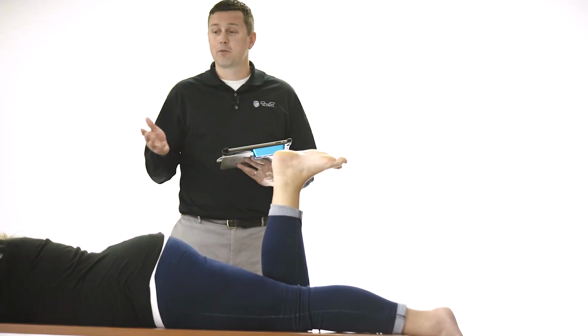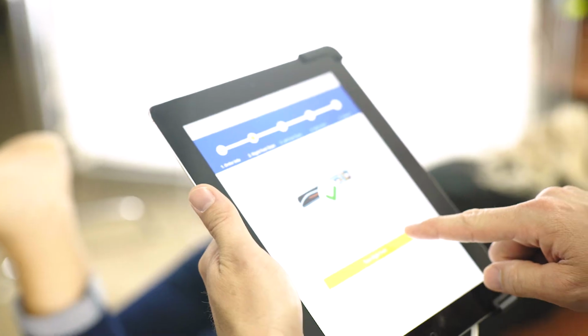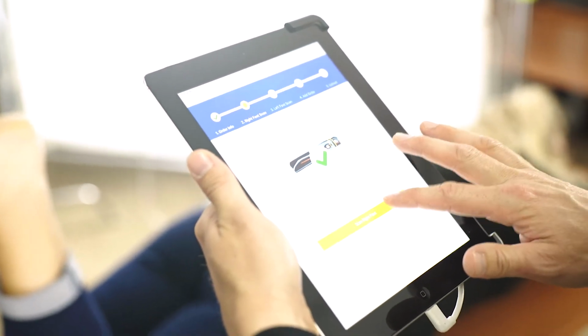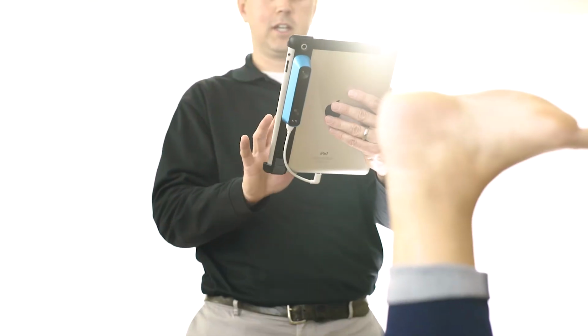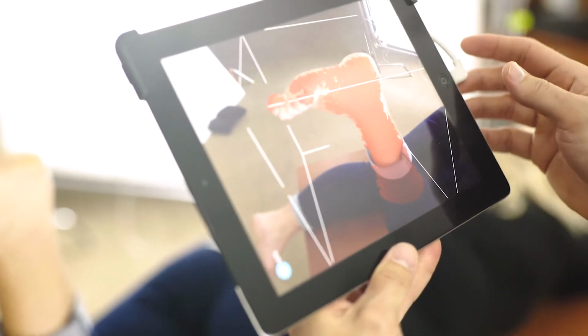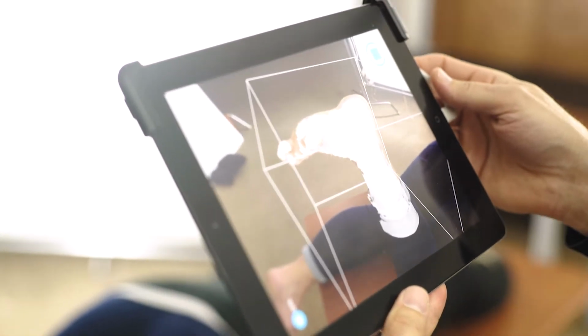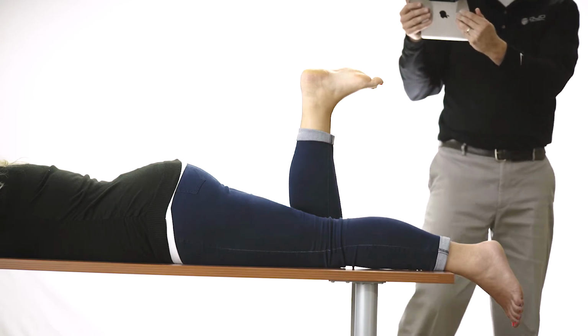Another method will be in the prone position, with the patient lying flat on their stomach. This may be a challenge for some patients. Their knee will be bent at a 90-degree angle. Their foot should be held at that position. I always start on the lateral side. We'll select the scan button, and keeping the foot in the 3-dimensional image as I start on the lateral portion of the foot, I will move slowly around the patient's foot.